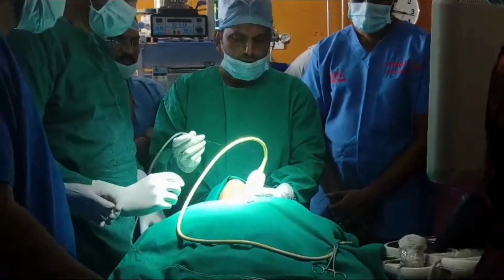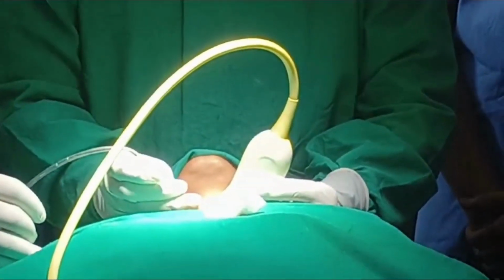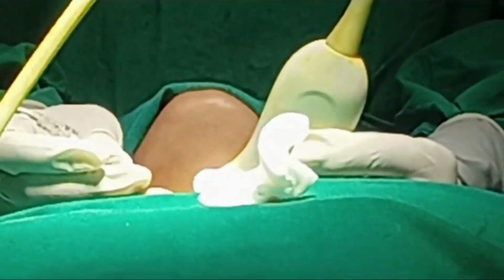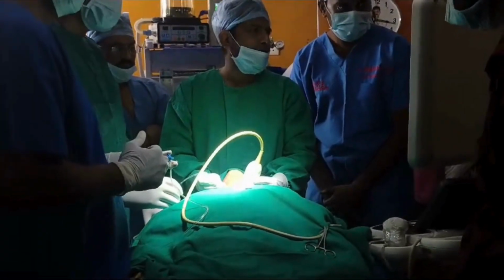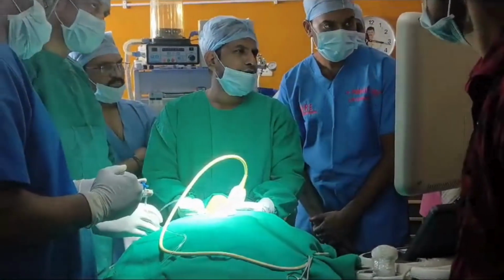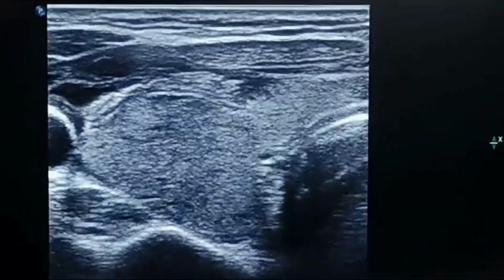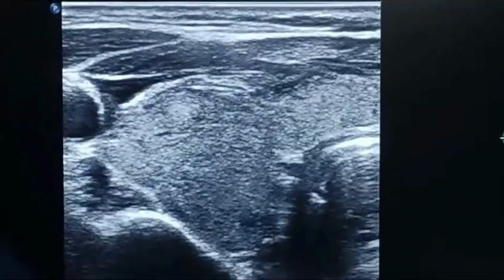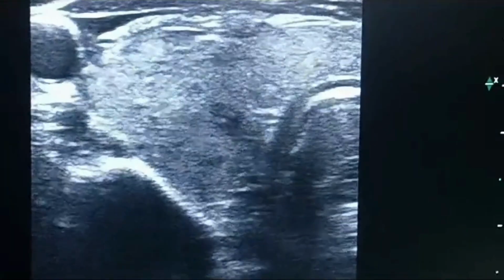Now, see, yes, now I am at the false capsule above, false capsule, strap muscle below. Inject. See this blade, okay? Now you can see this video for 5 minutes for observation. Then you come forward. Now the anterolateral hydrodissection. You see there, anterolateral hydrodissection of the carotid sheath.